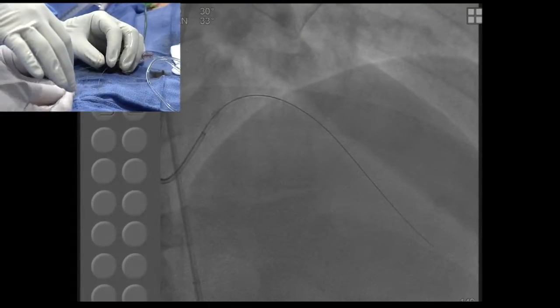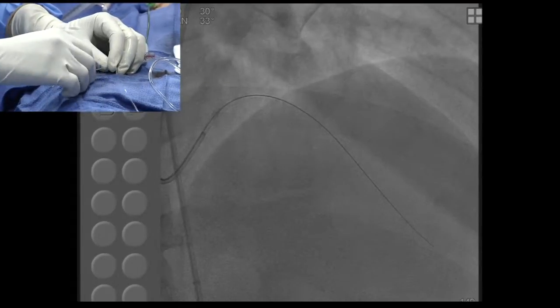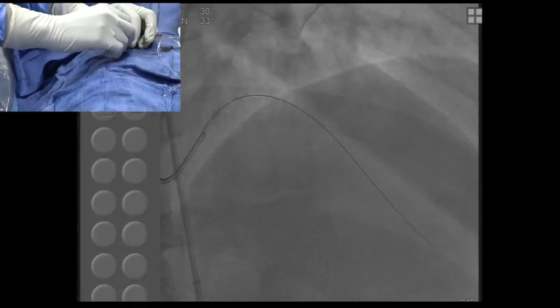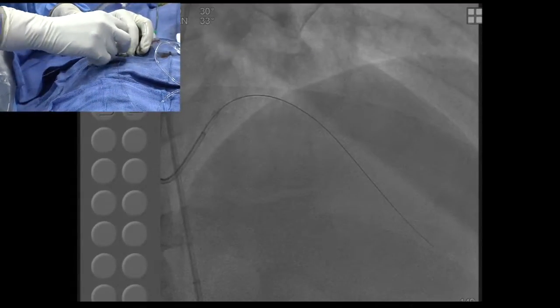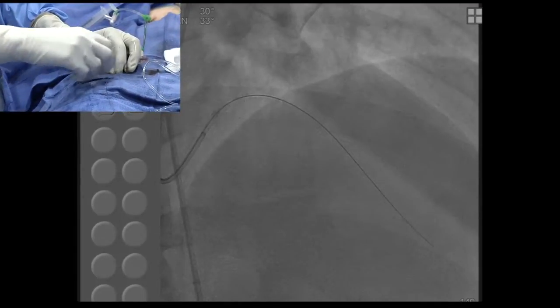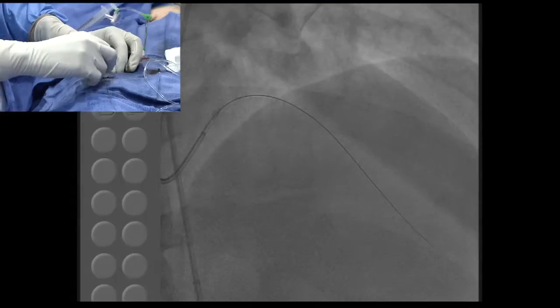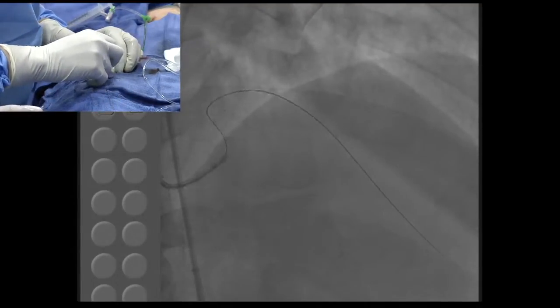And now with the newer generation of the V3, really very helpful, and as I said, this plastic, we are actually not having any stent stripping now. We used to have it quite commonly, and now it's no longer. Actually, yesterday I put even the 4038 Promus Element through the GuideLiner, and there was no problem.